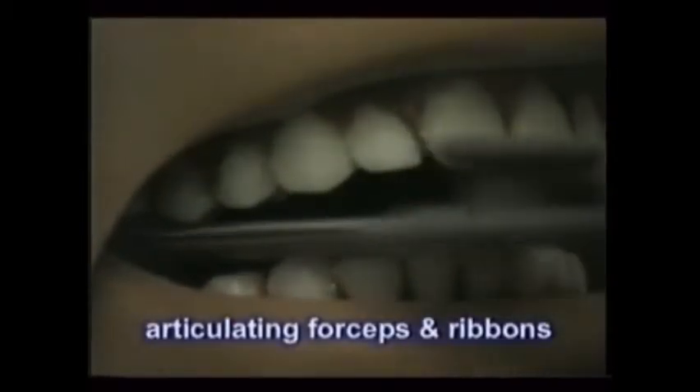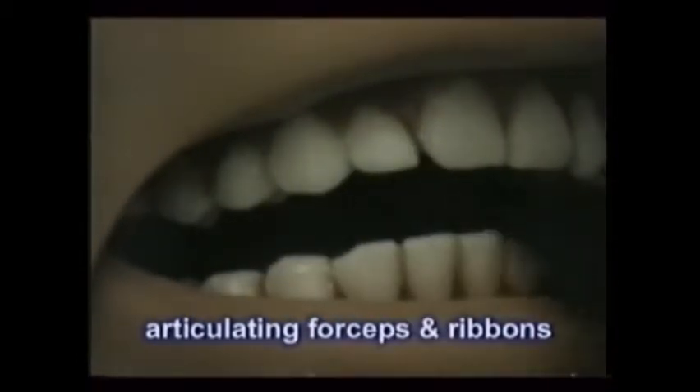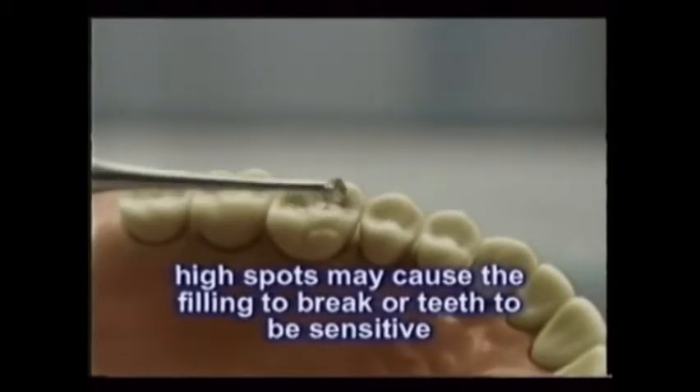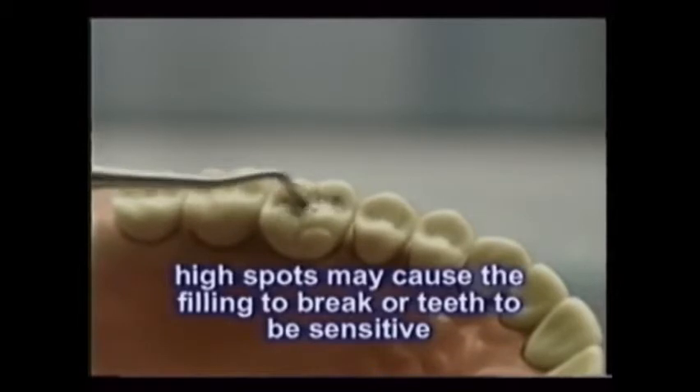Articulating forceps with red or blue articulating paper or ribbons help identify the bite relationship between a new filling and its opposing teeth. The bite ribbon marks high spots that must be carved down so that the filling won't break during early chewing or cause the tooth to become sensitive because of a bite discrepancy.